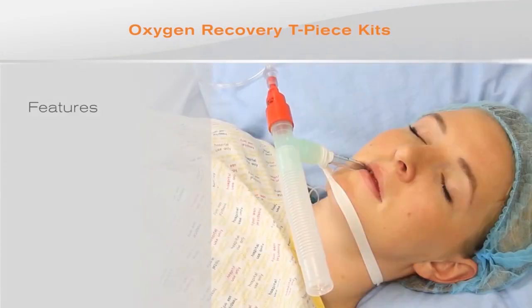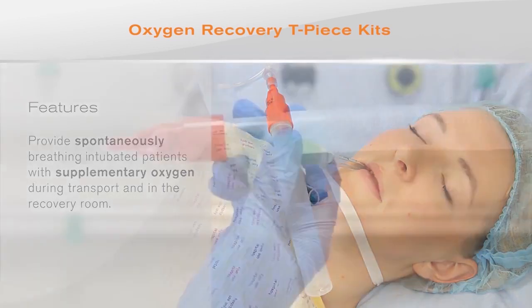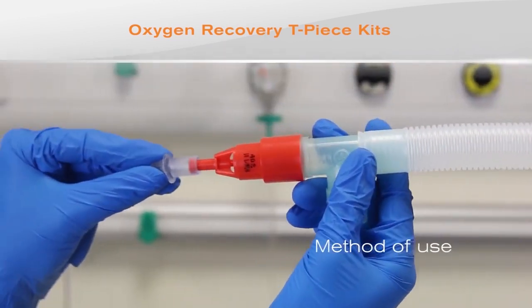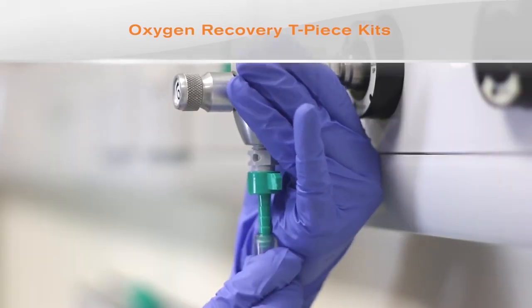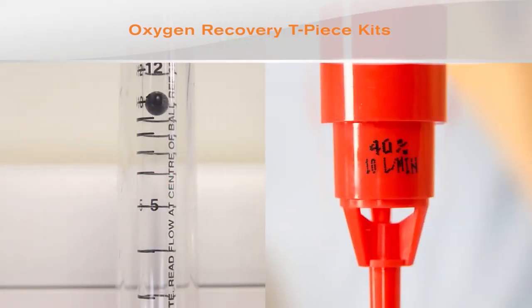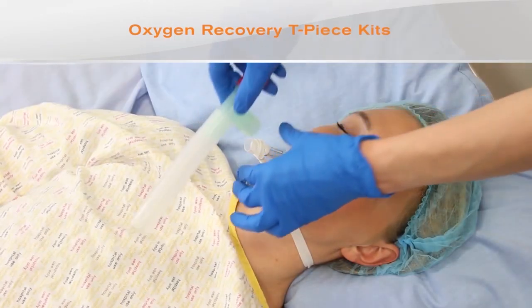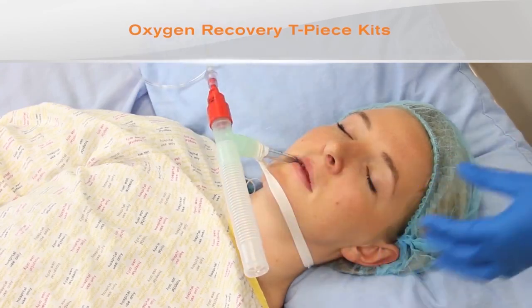These are used to provide spontaneously breathing intubated patients with supplementary oxygen during transport and in the recovery room. Attach one end of the oxygen tubing to the valve spigot and the other end to the oxygen flow meter, and set the flow meter to the flow indicated on the valve. Connect the T-piece to the 15mm connector of the tracheal tube or supraglottic airway device.